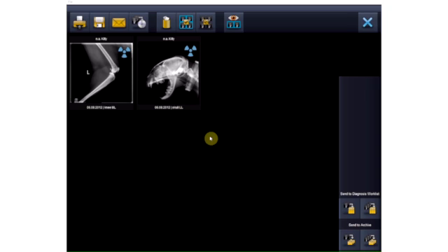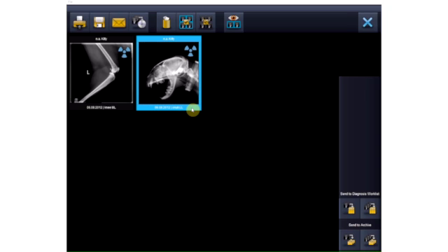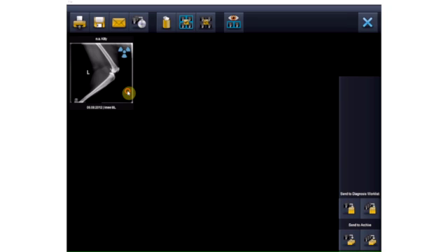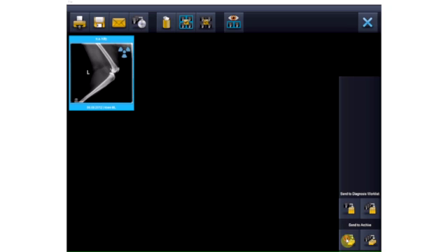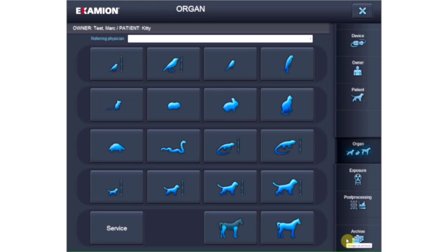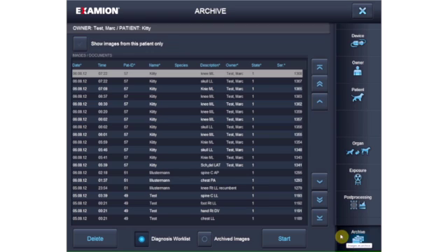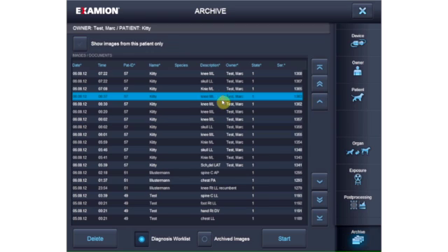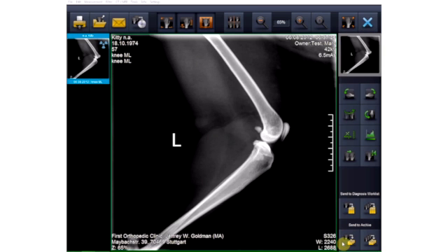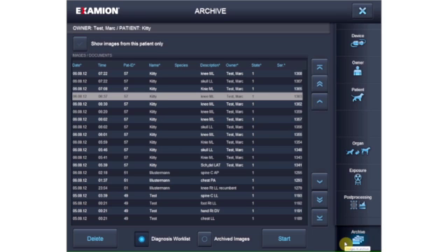For open diagnoses, X-ray images can be saved to the buffer diagnosis worklist or directly in the archive. Images from the diagnosis worklist can still be modified or processed without affecting the archive. The image should not be saved in the archive until all work on it is complete and it is no longer needed for the current case. Naturally, the image can be saved in the archive immediately or at any other point in time.